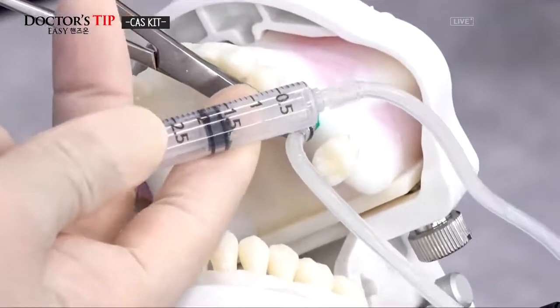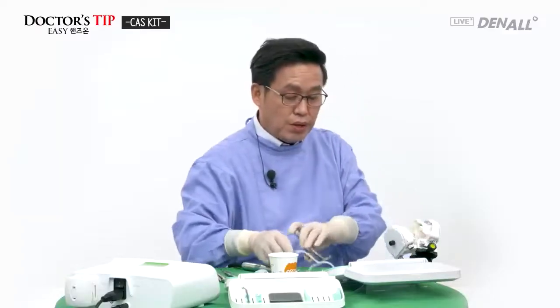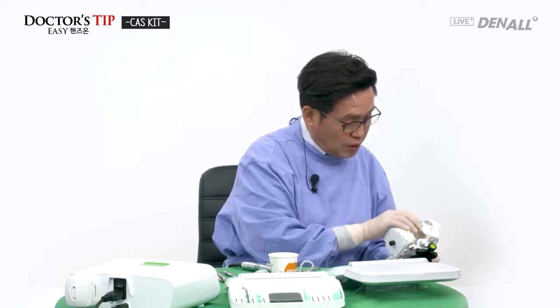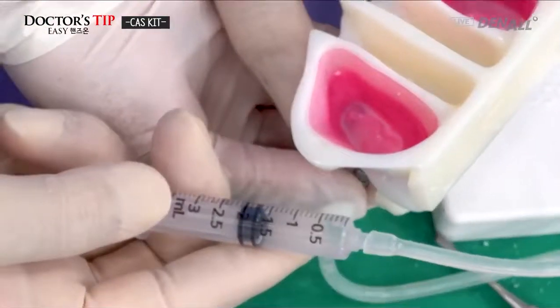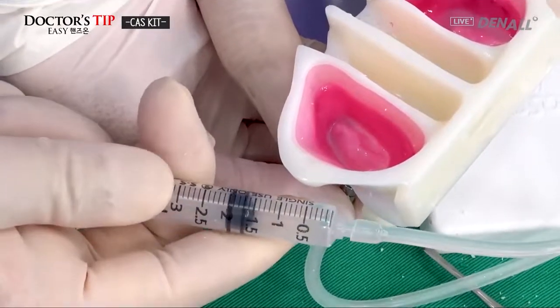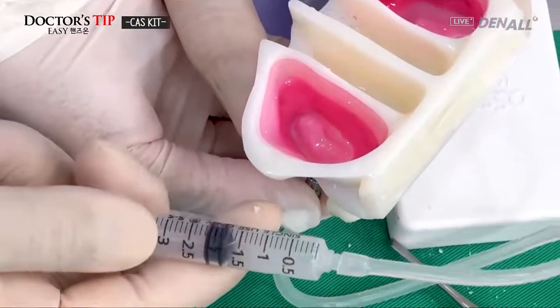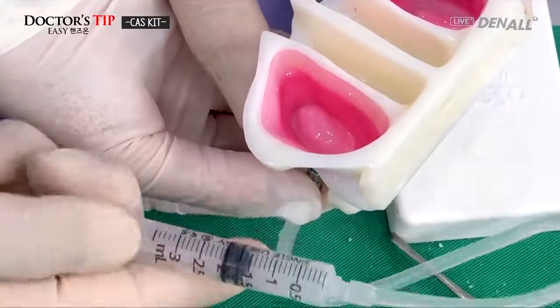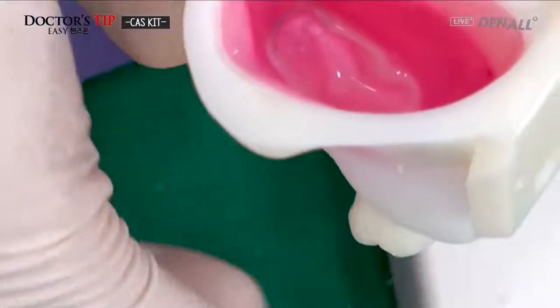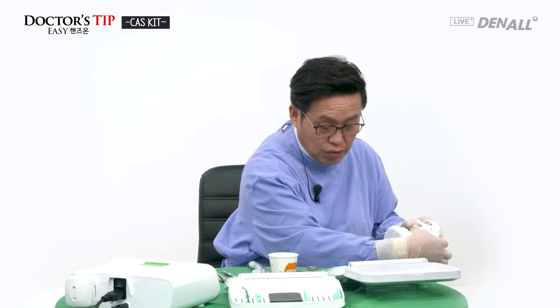Hydraulic lift is being done. Now it is lifted. Let's have a look at how it is lifted by removing this model. The mesial fixture is placed. When you do the hydraulic lift, you can see the membrane is being lifted. Aspiration. Negative pressure is formed, so it doesn't move anymore. We will do the bone grafting again and place the implant.